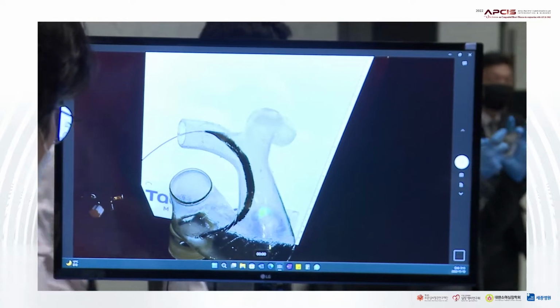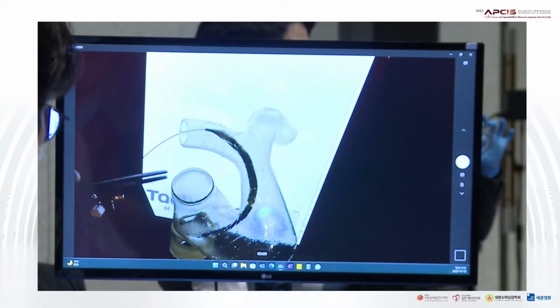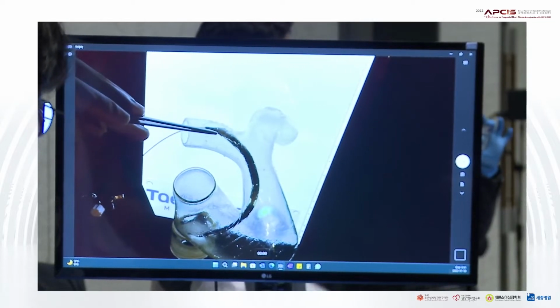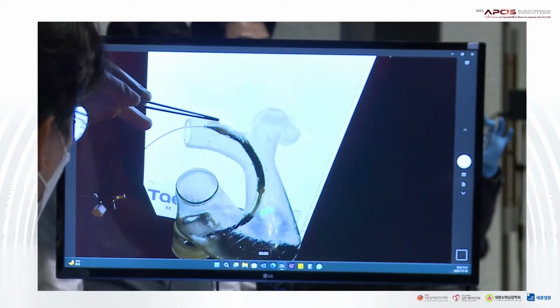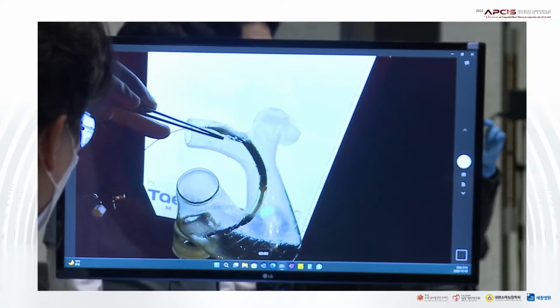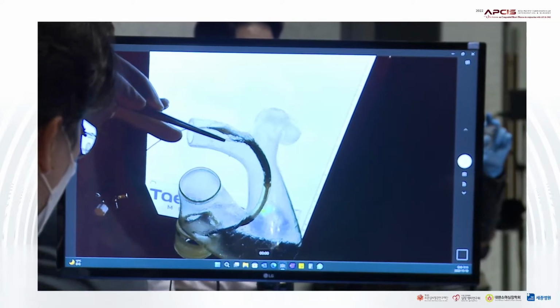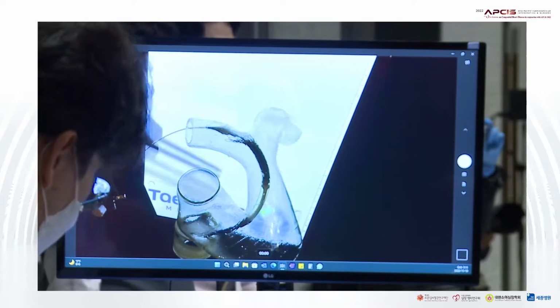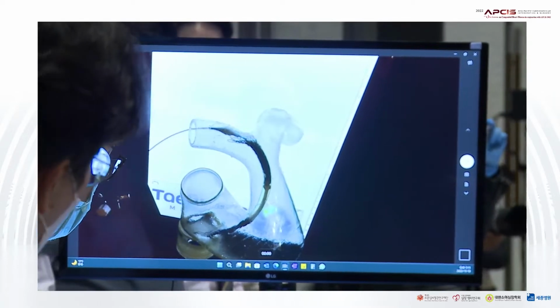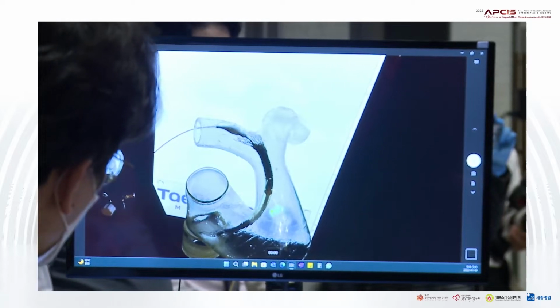And if you can show here, now the valve is opening slowly. Okay, slightly open. Now open more. Yeah, almost done. Do you want me to come back a bit more, or do you want to open more? It's the full open state.